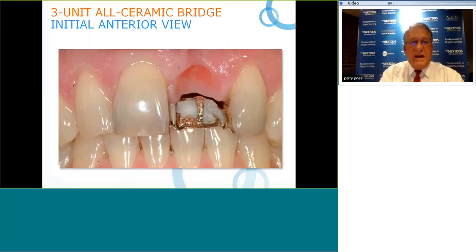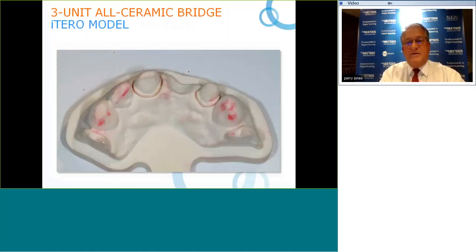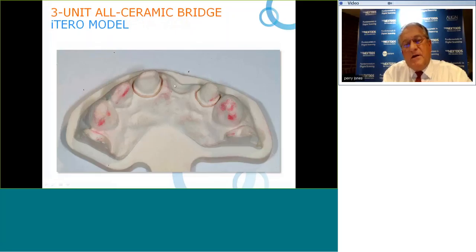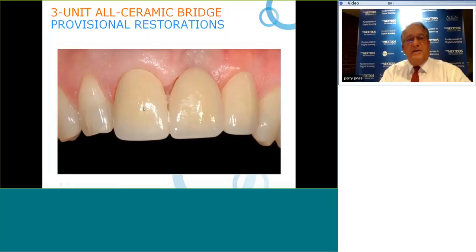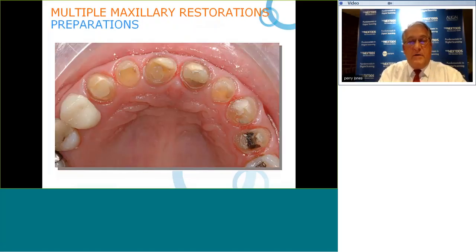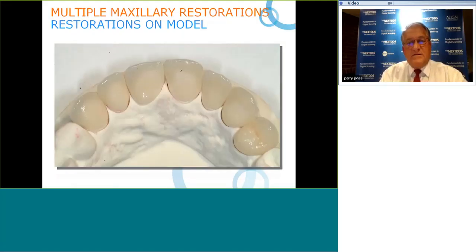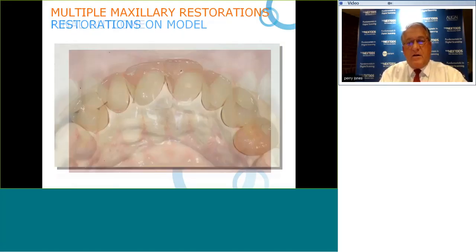Here is an example of a ceramic bridge — multiple units — showcasing the plethora of restorations possible. Notice how nicely the soft tissue is preserved in the pontic area using a physical model made by iTero. Here is a provisional restoration in place and the final restoration. We can do multiple restorations — for example, Invisalign to move teeth into optimal position with a simple express case, followed by minimal prep restorations.